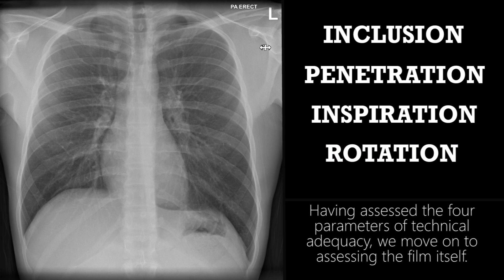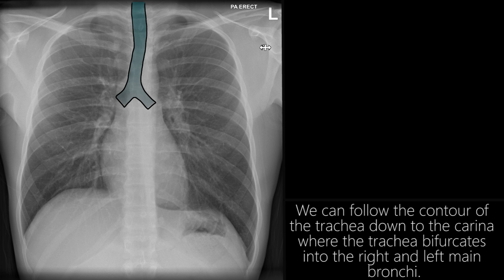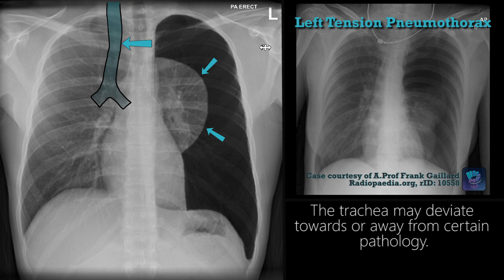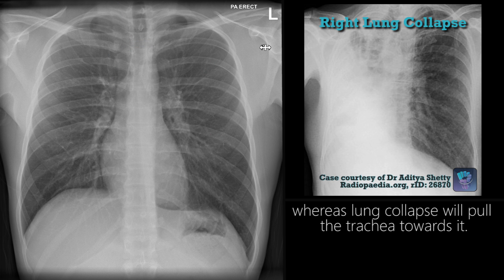Having assessed the four parameters of technical adequacy, we move on to assessing the film itself. We start with the trachea, which should be seen in the midline of a non-rotated film. We can follow the contour of the trachea down to the carina, where the trachea bifurcates into the right and left main bronchi. The trachea may deviate towards or away from certain pathology. A tension pneumothorax or large pleural effusion will push the trachea away from the affected side, whereas lung collapse will pull the trachea towards it.